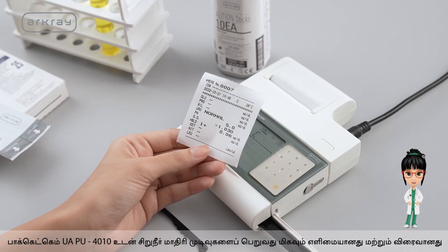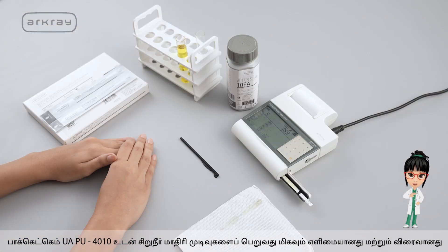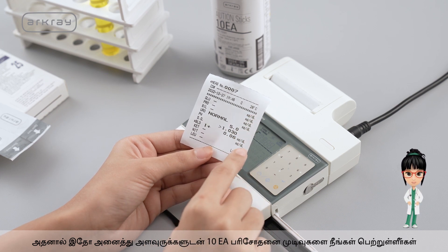Getting the urine sample results is very simple and quick with Pocket Chem UAPU4010. Here you have the 10 EA test results with all the parameters.